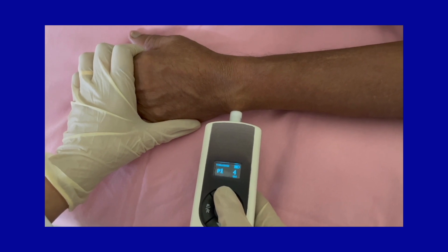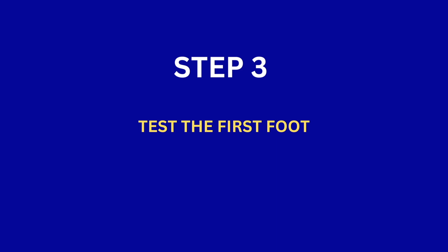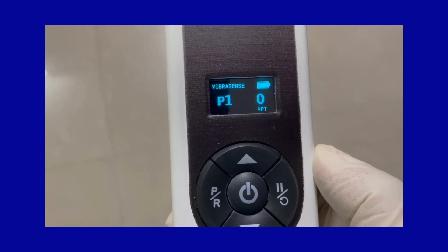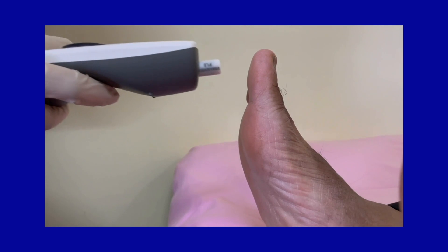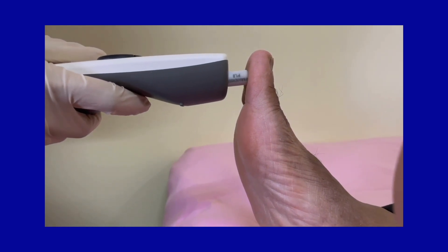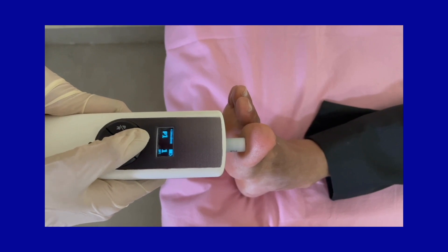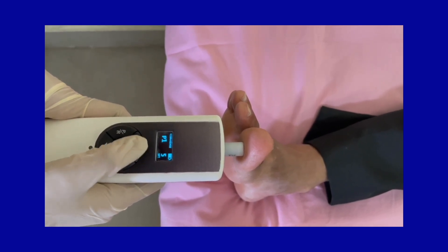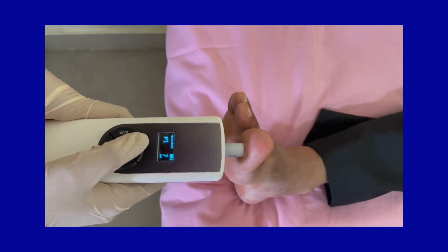Step 3: Testing on the first foot. Start from the default position P1 with the vibration intensity at 0. Apply the vibration probe at position 1, ensuring that the probe is perpendicular and gently touching the skin surface. Use the up arrow to increase the vibration intensity until the subject affirms feeling the sensation.